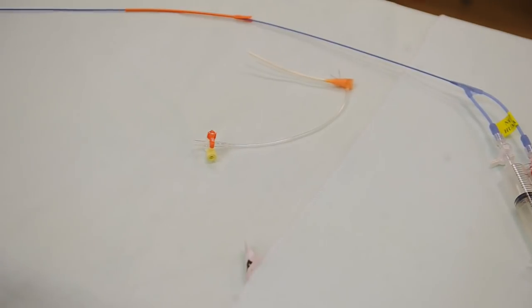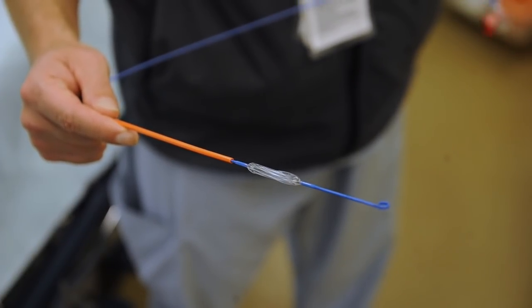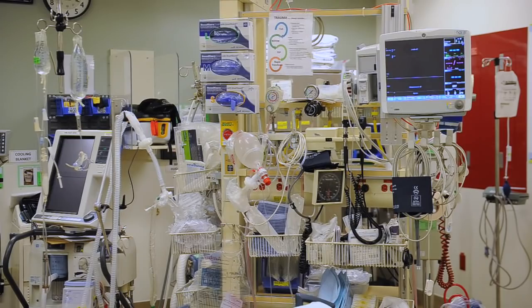The first time this concept was thought of was in the US. A military vascular surgeon used a balloon device to try and block the artery for injured patients. Unfortunately, it didn't work at that time, but it was used later on, where patients were dying at the time, and it didn't really come back into something that was easier to use till much more recently, in the last couple of years.